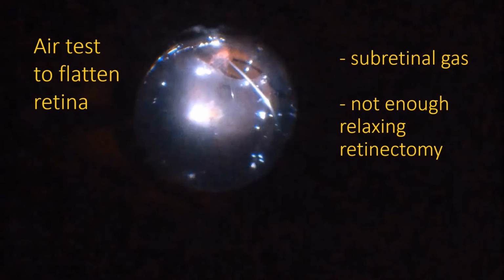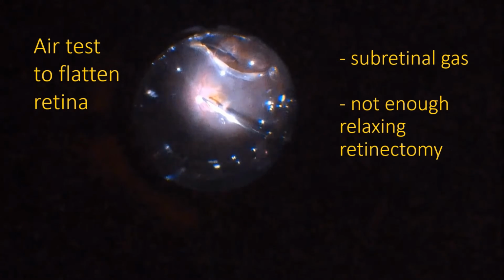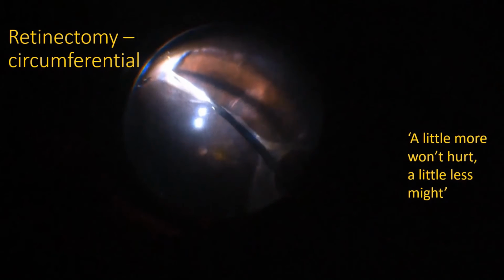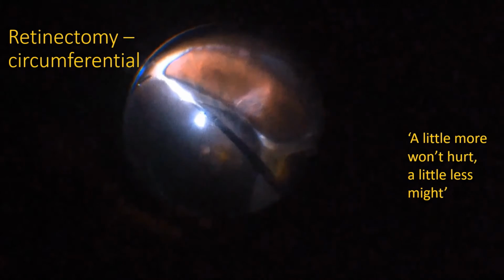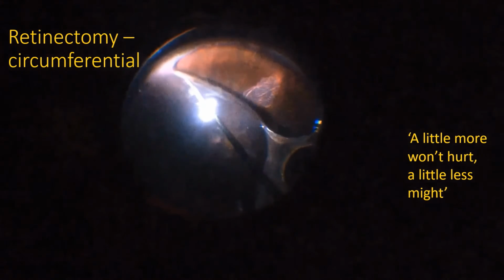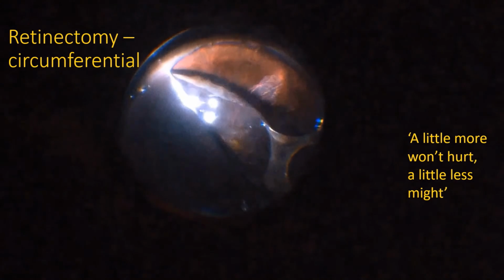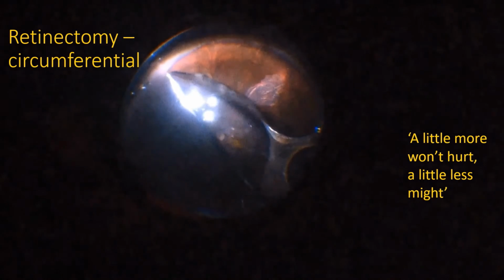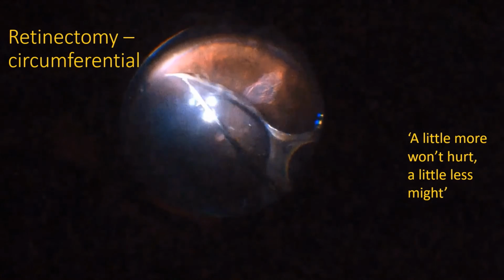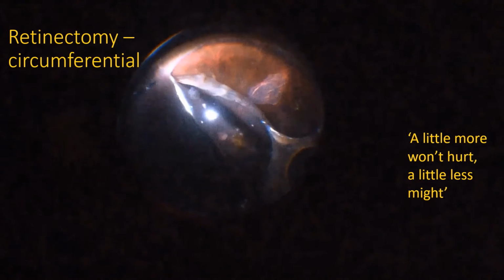The air test was performed. Unfortunately, because the retina remained shortened, the air went into the subretinal space. More retinectomy was done circumferentially. Be careful with the rotation of the eyeball, as the perfluorocarbon can migrate into the subretinal space.